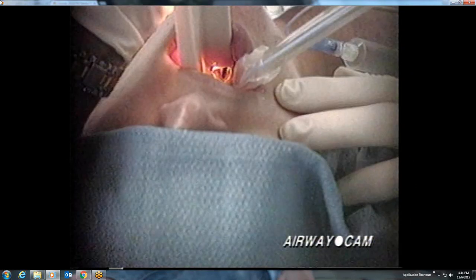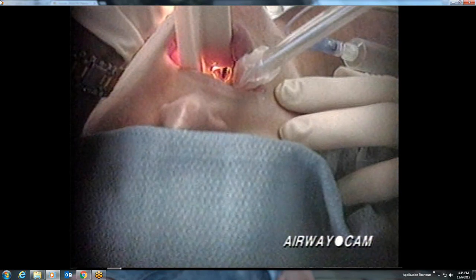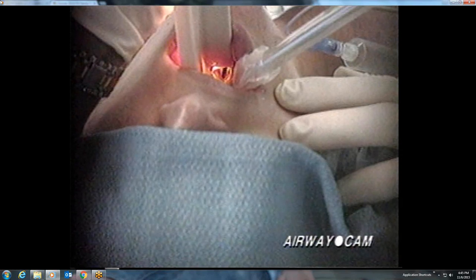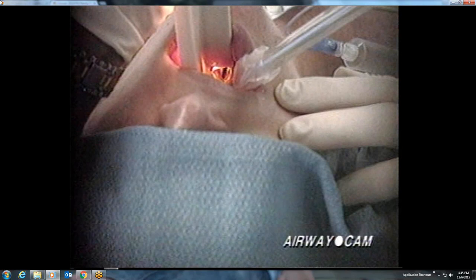Although the laryngeal view on this patient is excellent, the white of the true vocal cords is barely seen. Anterior to the glottic opening is the epiglottis. Laterally are the aryepiglottic folds. And posteriorly are the posterior cartilages and the interarytenoid notch.